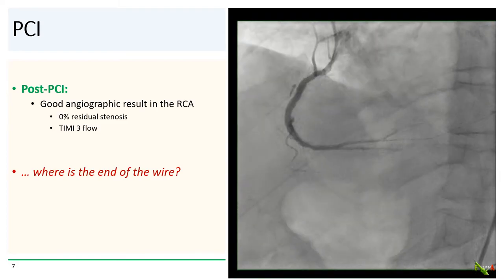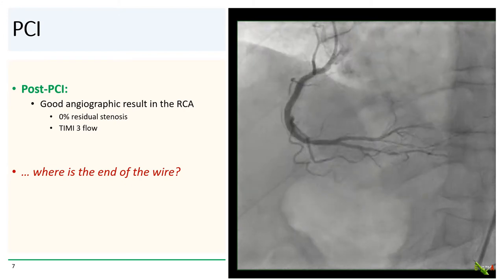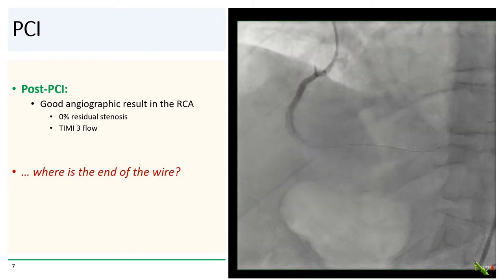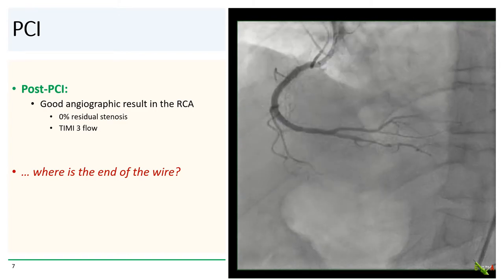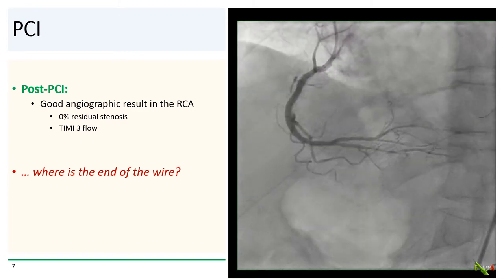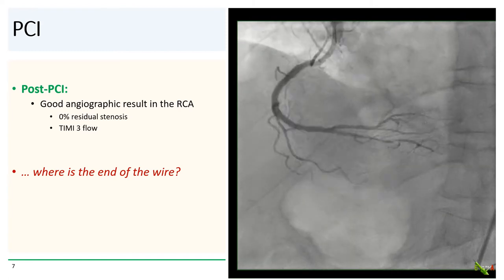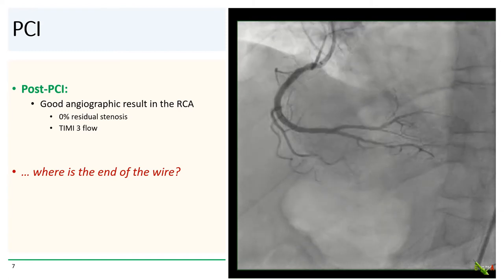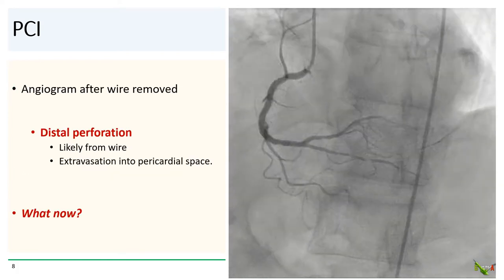The PCI procedure was very straightforward, and post-stenting angiogram showed a good angiographic result in the RCA with 0% residual stenosis in the stented segment and TIMI 3 flow. But that wire seems to have migrated quite distally — where is the end of the wire? And here is the angiogram after the wire was removed.